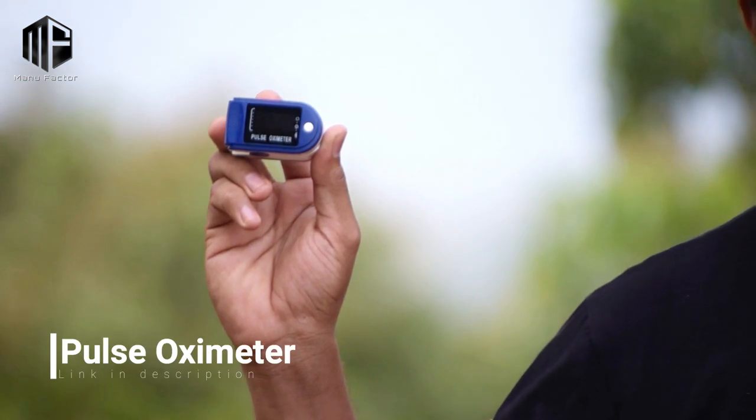For COVID, we are going to use a device. What we are going to review is a pulse oximeter — specifically a fingertip pulse oximeter that measures oxygen saturation in our blood, meaning oxygen level and oxygen concentration, as well as pulse rate.